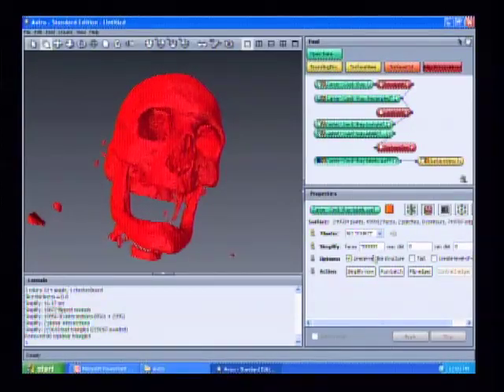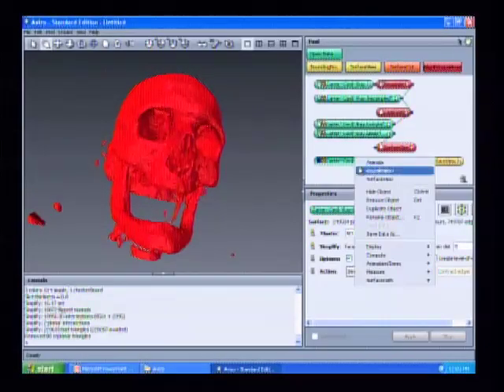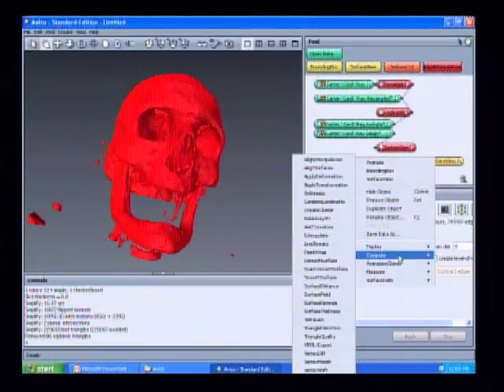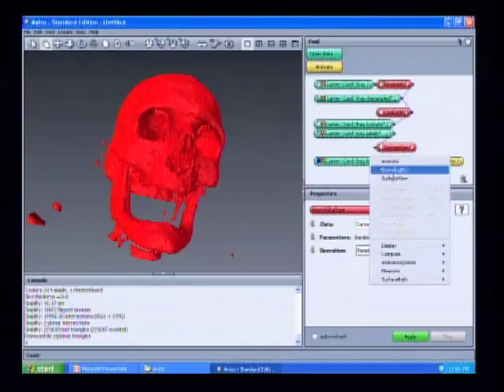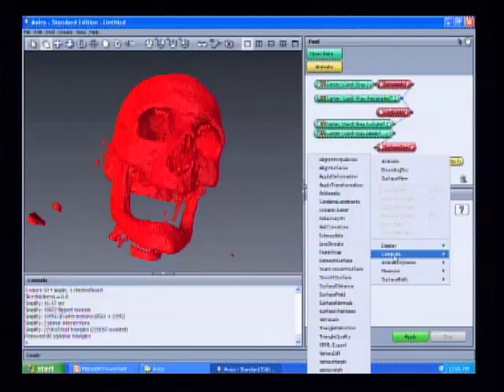The next step is to right-click on your surface file, go down to Compute, and select Smooth Surface. So you want to right-click this surface file. Once it's down to 500,000 faces, go to Compute and Smooth Surface.